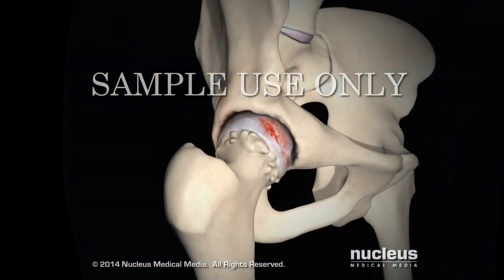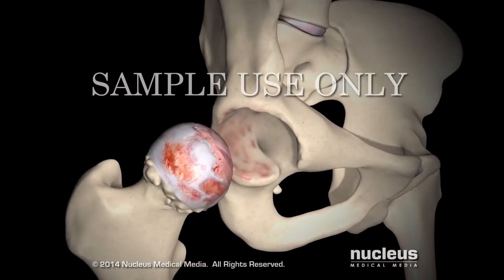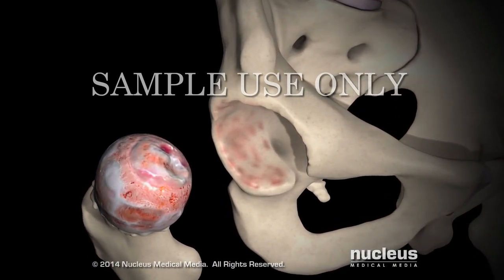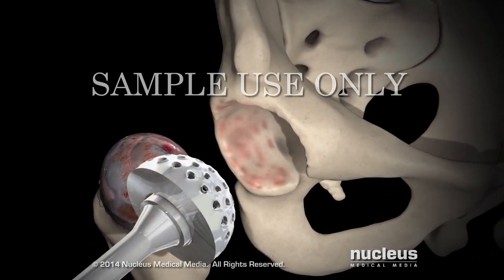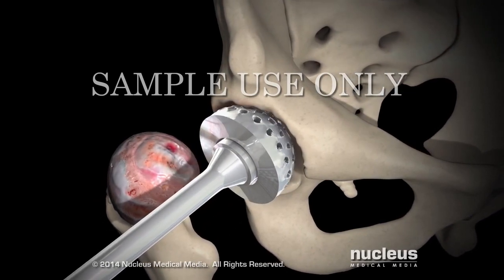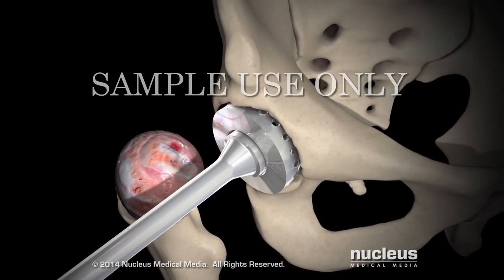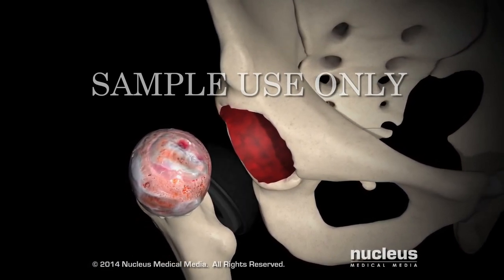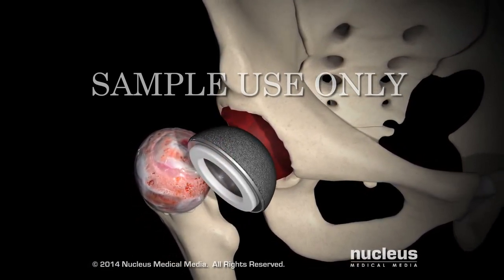After incising the joint capsule, your surgeon will dislocate the femoral head from the acetabulum. He or she will remove any damaged cartilage or bone in the acetabulum, reshape the acetabular socket, and secure the acetabular prosthesis in place using special cement or screws.